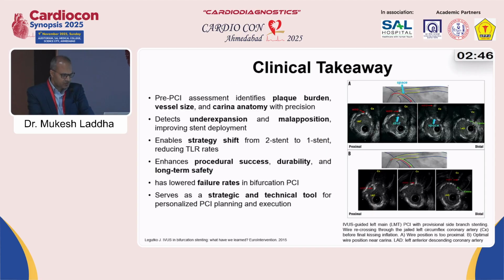So IVUS-guided angioplasty identifies the plaque burden, vessel size, and the carina anatomy with precision. It detects under-expansion and malapposition, improving the stent deployment. It enables the strategy shift from two stents to one stent, reduces the TLR, and enhances procedural success and durability, with long-term safety and a reduced failure rate.